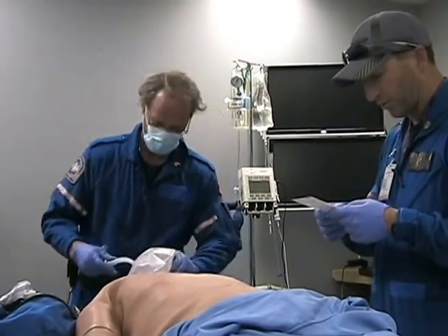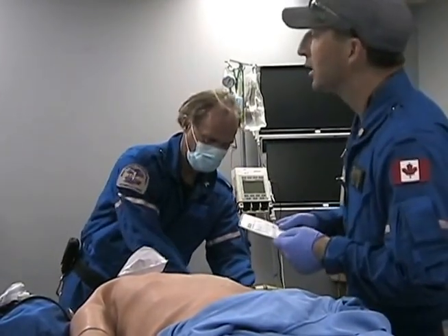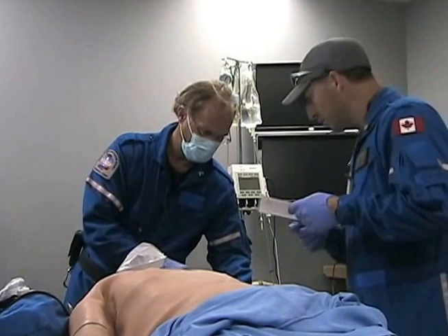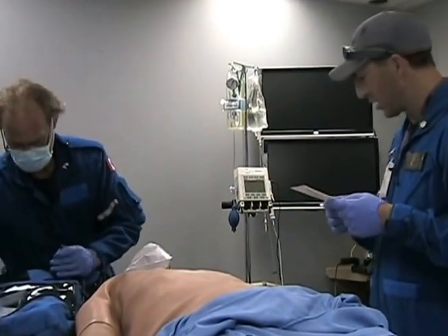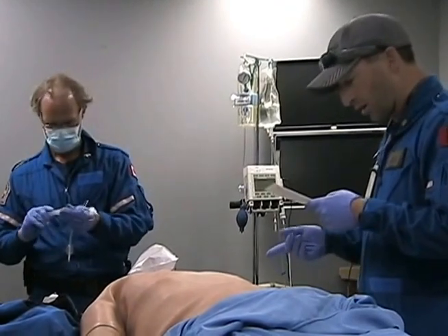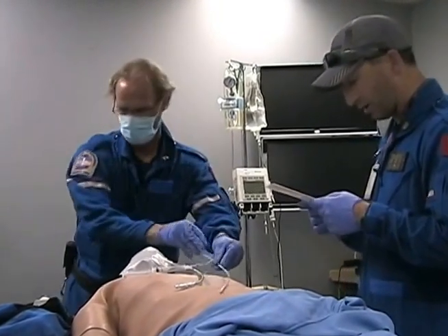PPE, I got gloves on. BVM, plus or minus PEEP valve. Yeah, it looks like that's on over there. Suction tested. Yeah, it looks like it's on, it's working. Laryngoscope tested, no, I see you just did that. ET tube, cuff size tested. Yeah, it looks like you got the tube out. I'm sure that's good enough. Backup airways, LMA. Yeah, that's out. End tidal CO2's good. ETT holder, yeah. Sources of difficulty, yeah, he looks pretty good. ELM, suction, bougie removal, yeah, I can do that.